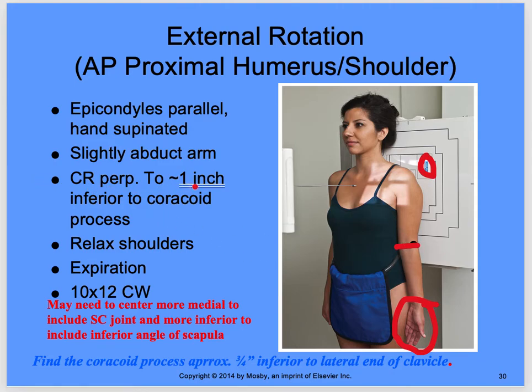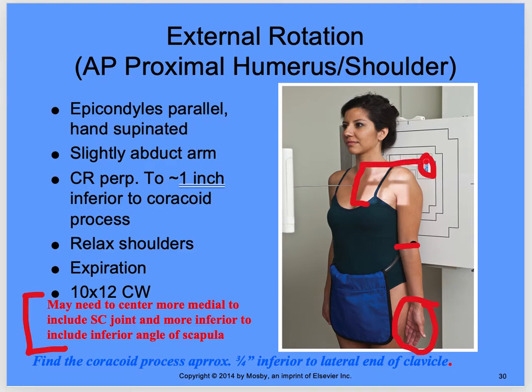Central ray is perpendicular to one inch inferior to the coracoid process. Relax the shoulders. Keep in mind that for the shoulder, you may need to center more medial to include the SC joint, and more inferior to include the inferior angle of the scapula. You may need to adjust your light field here — I usually split the jugular notch and then make sure that I have that light field above the shoulder.